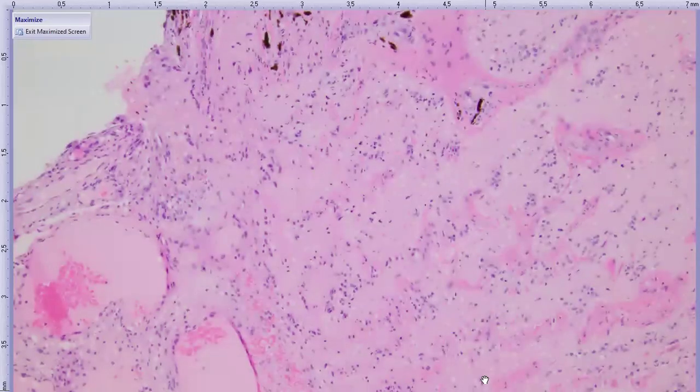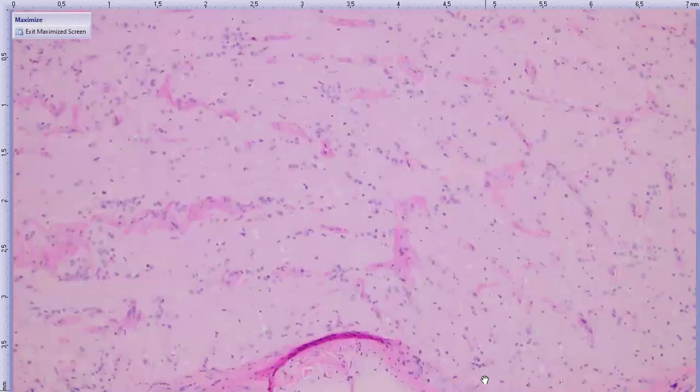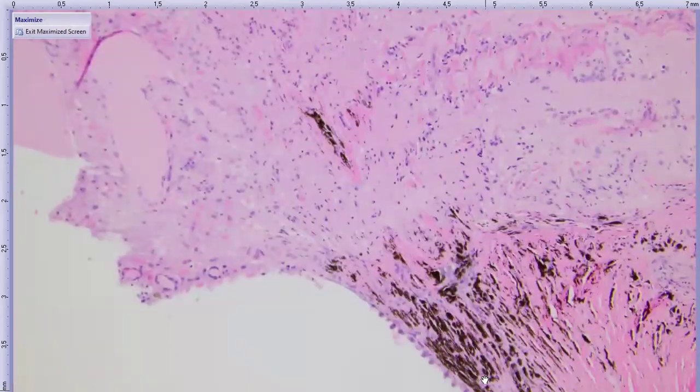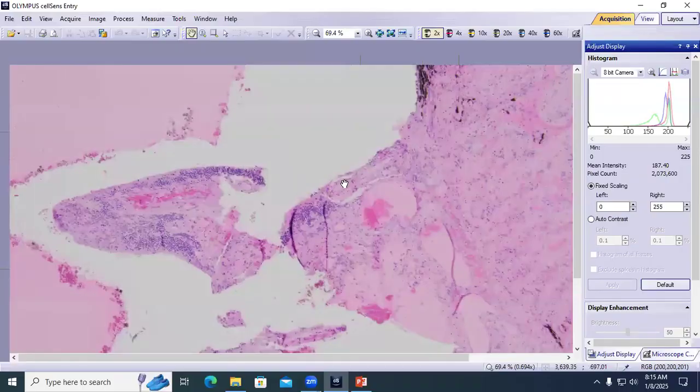And then otherwise, as I mentioned, optic nerve head is rather distorted. The optic nerve is mildly gliotic, which we can see in case of glaucoma. It's by no means pathognomonic, though. Just a supportive feature in this case. So those are our major features of this globe.